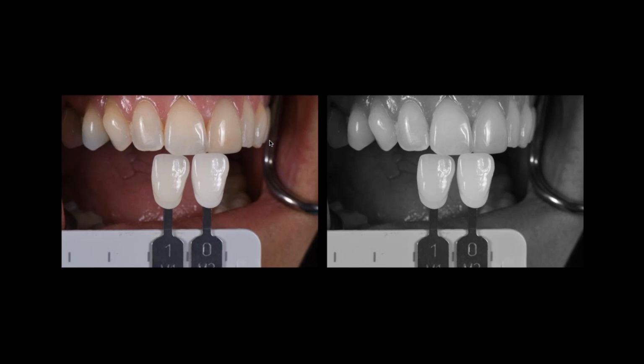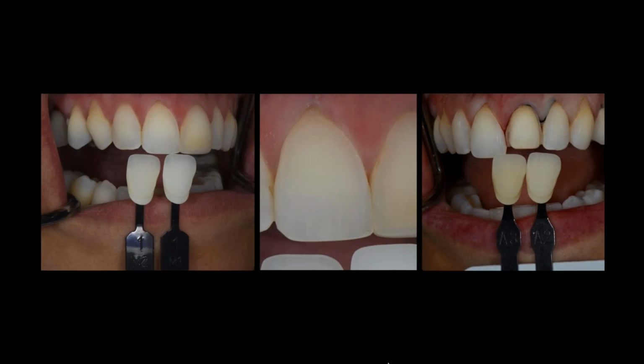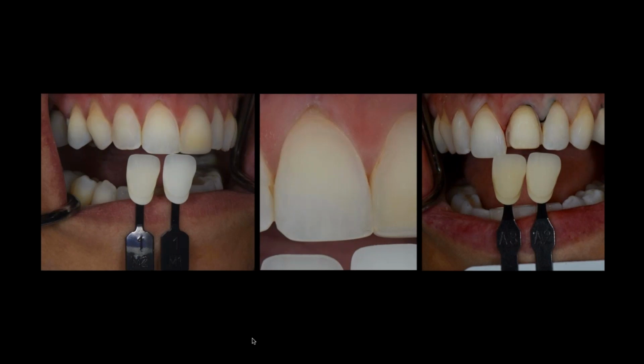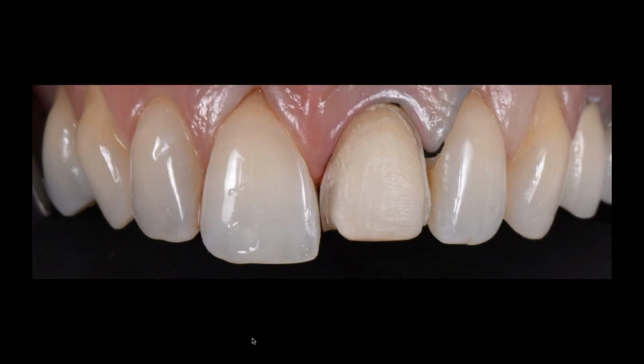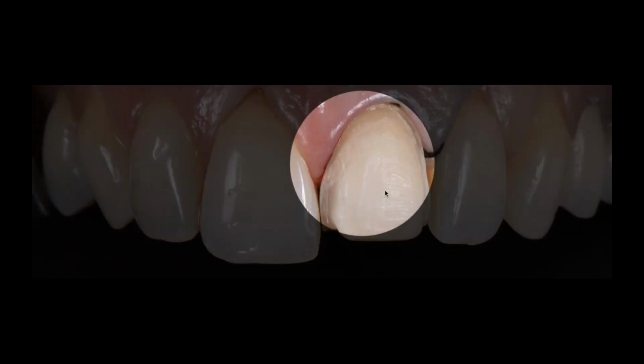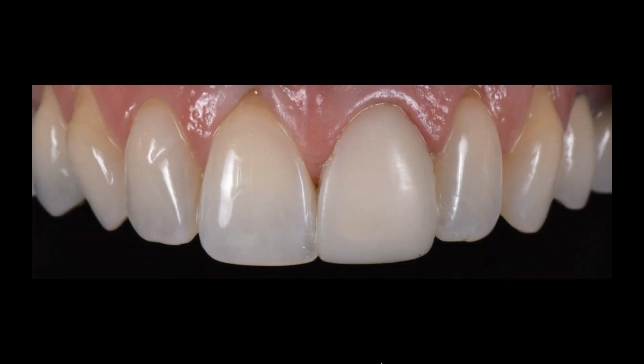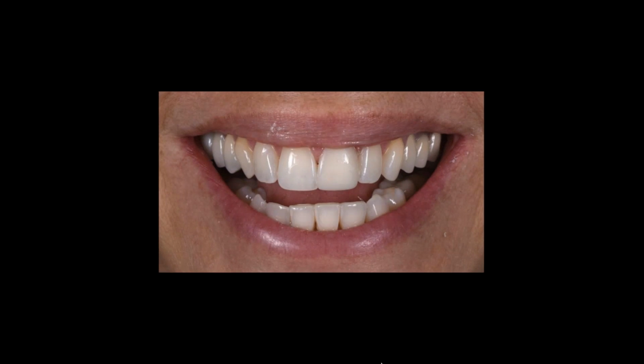I want to take all the standard photos that I told you about. Notice I have 2 guides for reference. I can also shoot that in black and white if I wanted to, or in polarized, which is very important for me. And you'll notice the polarized again gives me that little bit of opacity and the amount of translucency that I can see. We're going to treat this as a veneer restoration, so it'll be very minimally invasive. And the prep shade is fairly good, right? You can actually see the coloration on the prep already. The value is not bad. I just have to really incorporate the translucencies and the colors that are there. So we provisionalize the patient, send the patient home, and I'll go back and fabricate my final restoration.